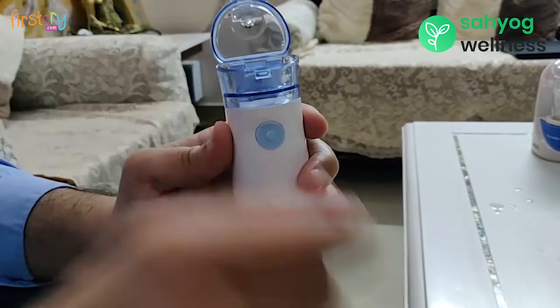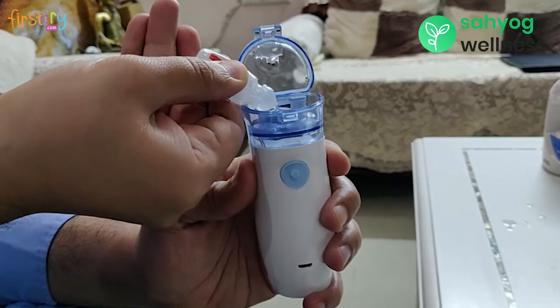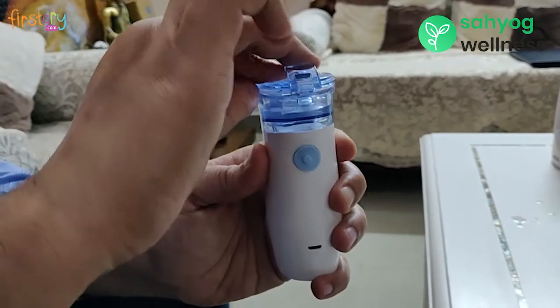Open the chamber and put medicine into it as described by your physician. Close and lock the chamber cover.